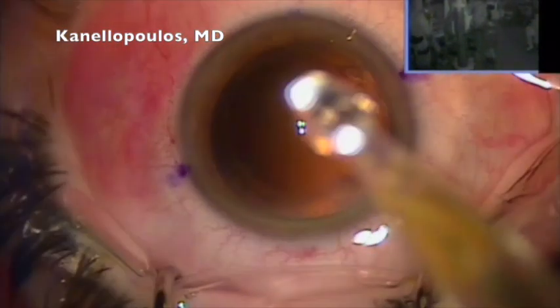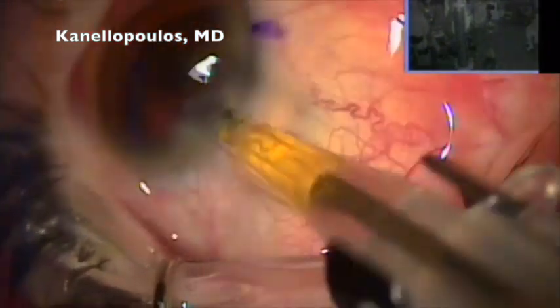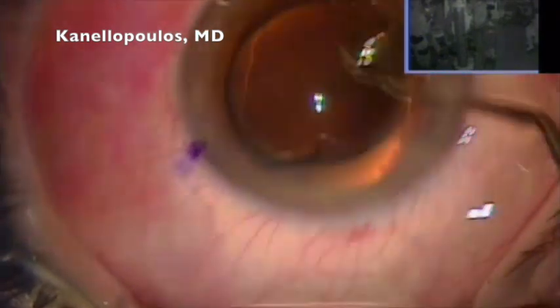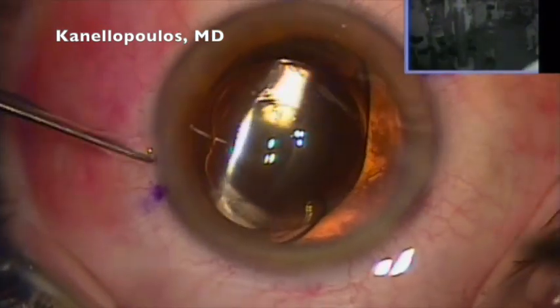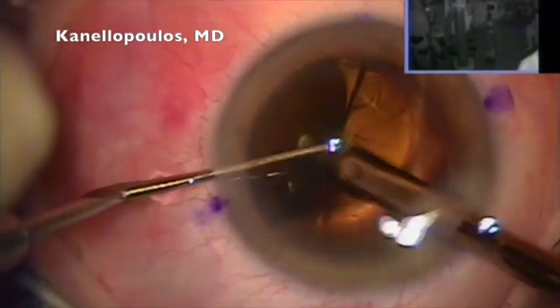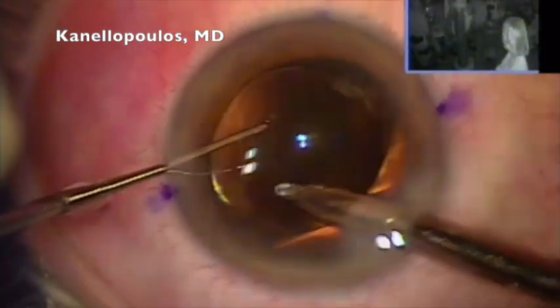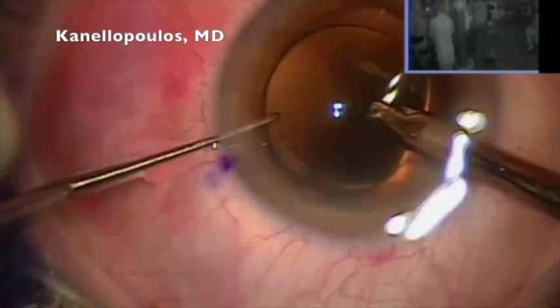And again, this is the dominant eye. We're targeting a minus 0.2 in sphere and half a diopter with the rule astigmatism. So this is an astigmatic lens. Same thing, pretty much standard lens in the bag. Use irrigation aspiration to remove viscoelastic from underneath the bag. Very careful here not to tag the posterior capsule. And again, I noted previously why this is important for effective lens position.